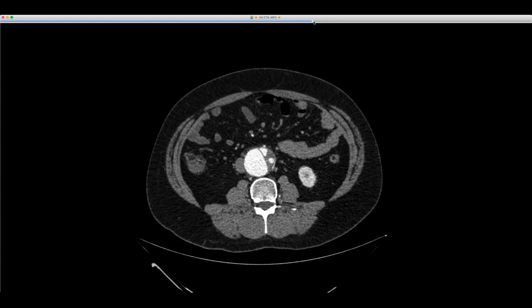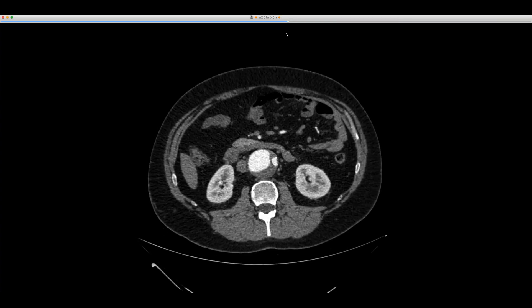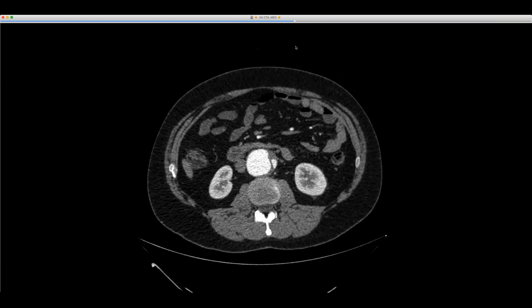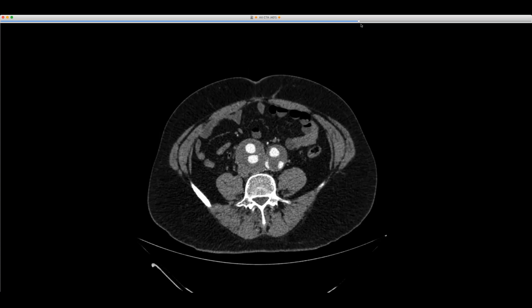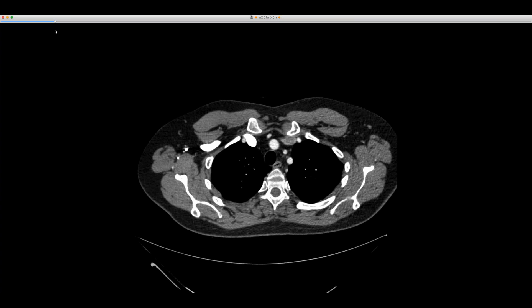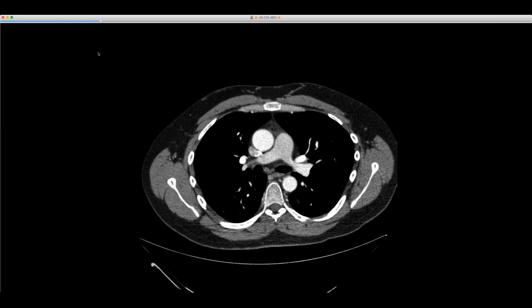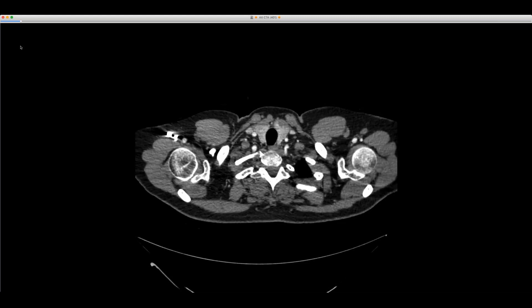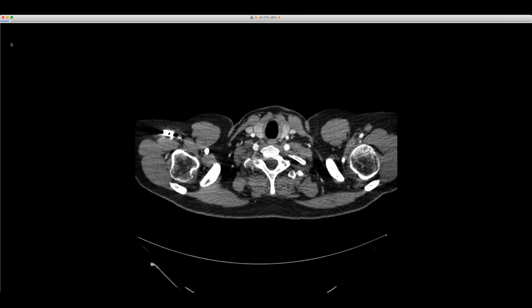It starts in the infrarenal abdominal aorta — not a typical dissection — with multiple channels and aneurysmal iliacs. But look up here at the chest. For a Marfan's patient, I was skeptical because the scan doesn't look particularly Marfanoid. Coming up here, look at the vertebral arteries — those aneurysms of the vertebral arteries, with this corkscrew-like tortuosity of the vertebrals — leading us to consider Loeys-Dietz syndrome.